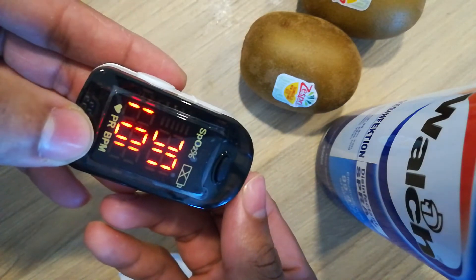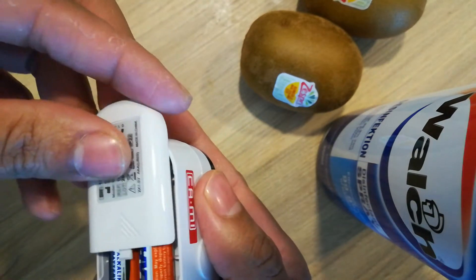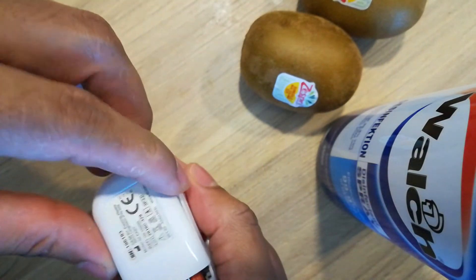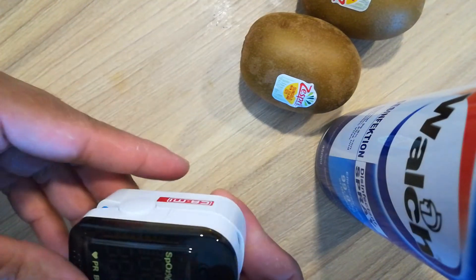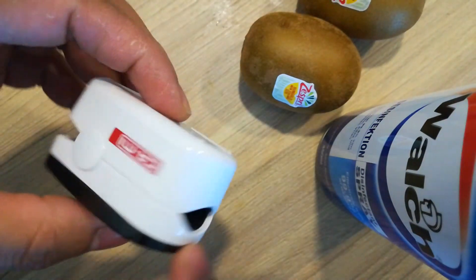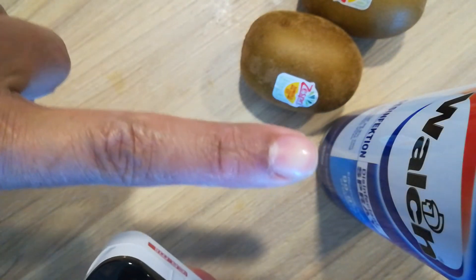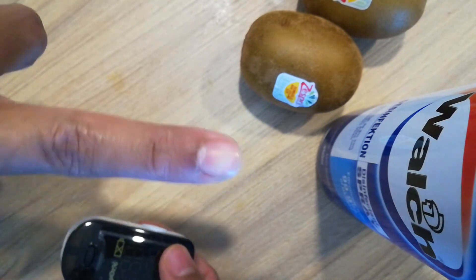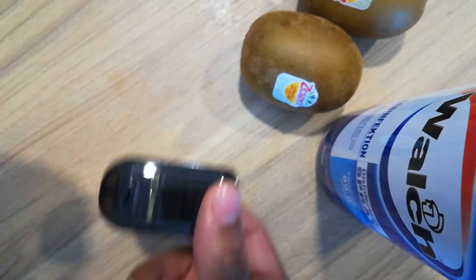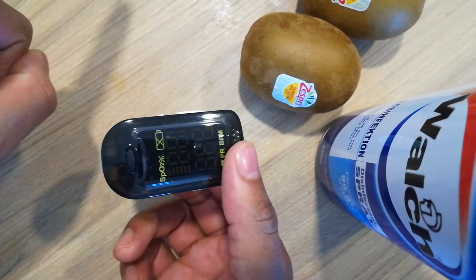Power is on, so we have to close this cover very smoothly. Alright, so it's off now. To use it, this is the finger — you have to put the finger, put this finger on the left hand. They show left hand — this finger.